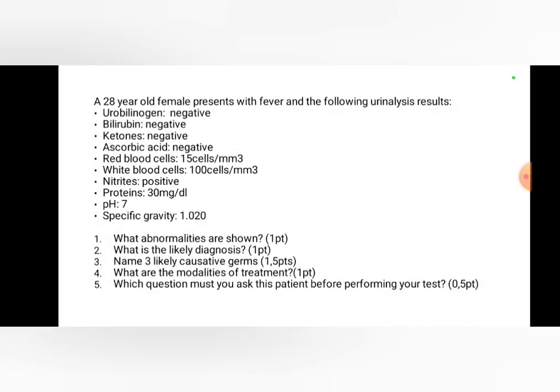Now, bilirubin, when it's present, is a marker of a high level of conjugated bilirubin. If you see both, it means that both of them are high. Are you understanding? Now, the next point is ketone. Ketone, at least 2+, can tell you of a diabetic ketoacidosis.